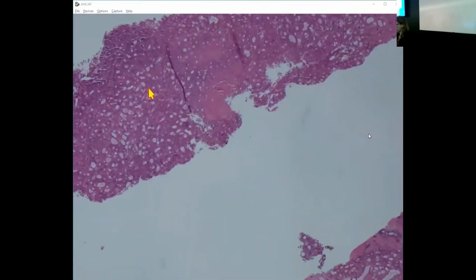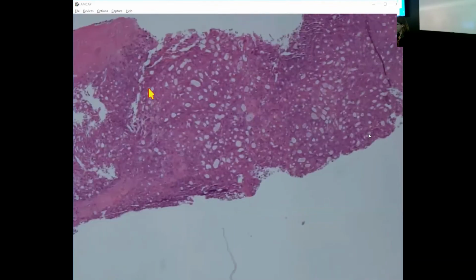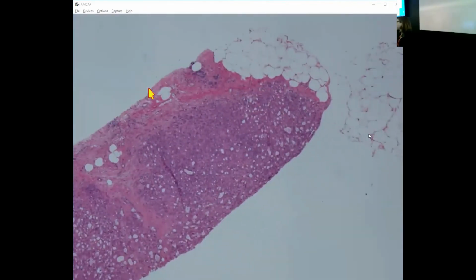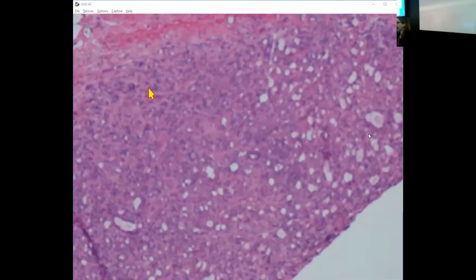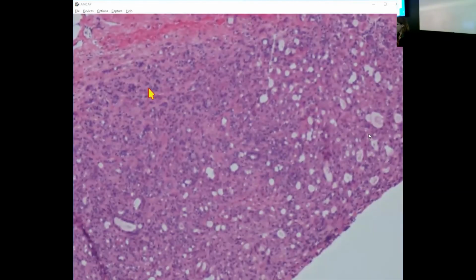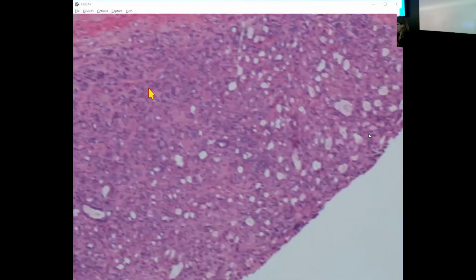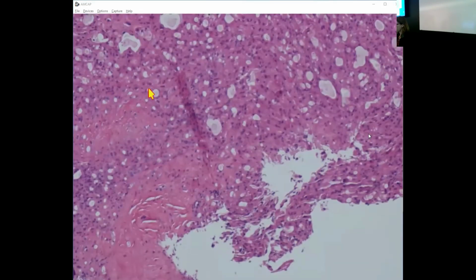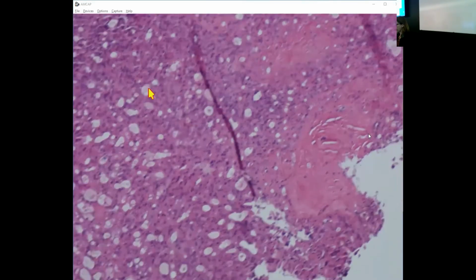So the epithelium is very pink in this case. Apocrine adenosis. Yeah, apocrine adenosis. So it looks like adenosis, I think. I agree with you, right? So it looks sort of like rounded nodules. But as was pointed out, it's very pink.